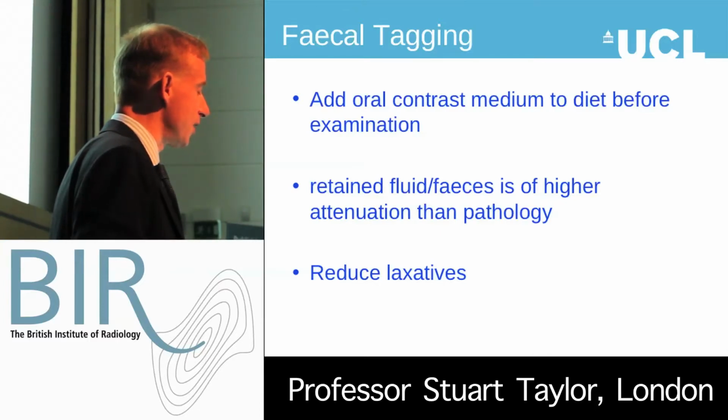And tagging is adding contrast medium to the diet before the examination, so anything that's left in the colon is tagged white, so you can see it very easily. And it's a very good way of reducing laxatives, something the endoscopists can't do. So again, potential advantage of CT.